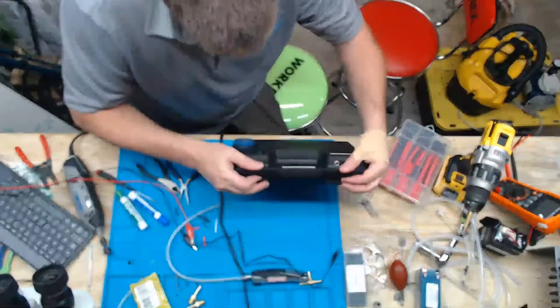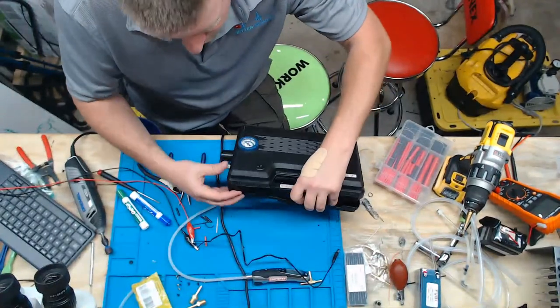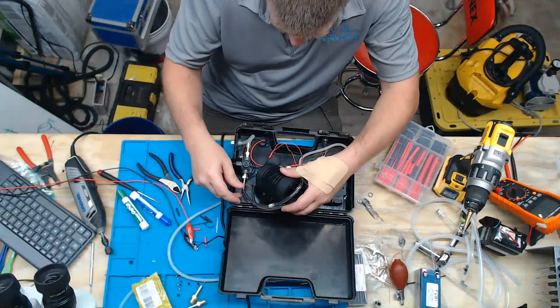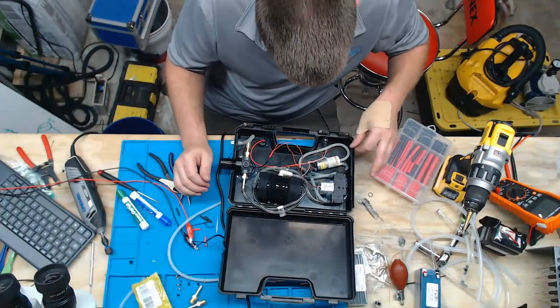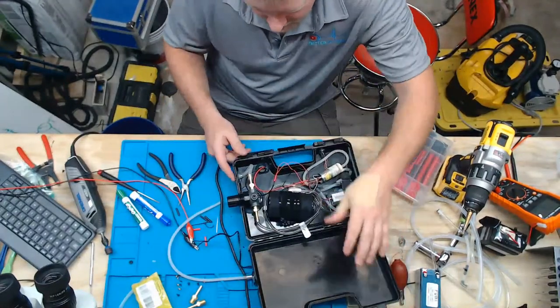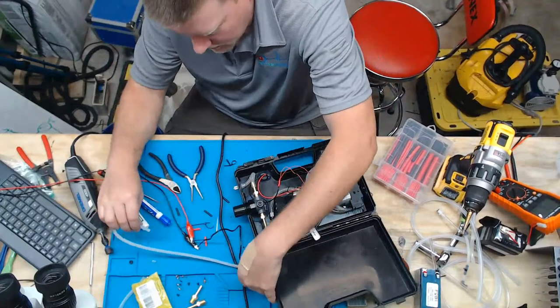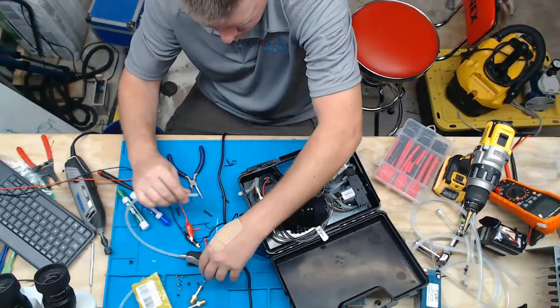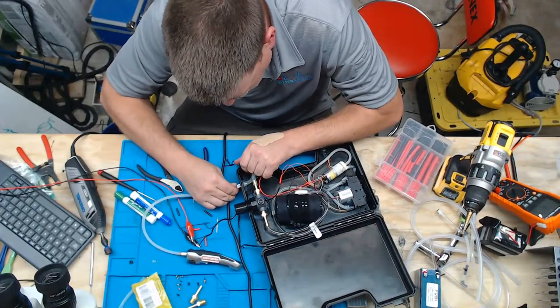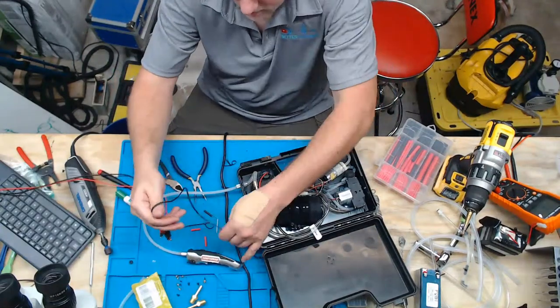Uh-oh. What did I do wrong? I probably popped a hose off. 22 PSI is a lot of pressure. That's a crazy amount of pressure for this tiny little pump system. Let's see. I got that guy. Hell, I'll do it with the cover open, just so I can see if there's a hose that's popping off someplace. Okay. Get my pressure gauge. Here's this one. All right. And DC power.